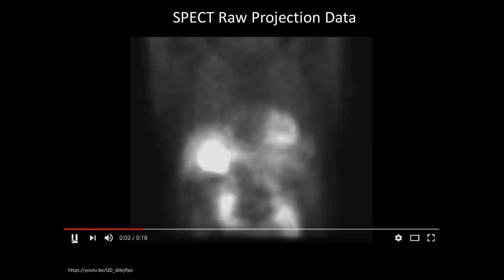This view that we're looking at right now is classic nuclear medicine called the Anger camera. Before they did reconstructions of 3D data sets, they would just do one view and look at that single view.